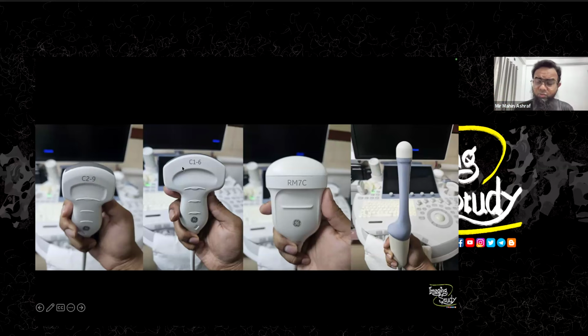This is the common transducer like C16. This is the popular curvilinear transducer. I have the 3D transducer, which is the RM7C. This model is very good, a little bit expensive, obviously, but it gives a very good resolution. So I use it for fetal echocardiography also, because this 3D transducer is very lightweight, not like other bulky ones, and it has a very good resolution. So for obstetric scans, I highly recommend this transducer. And this one is the TVS probe with 3D functionality here also, and it's also very good.